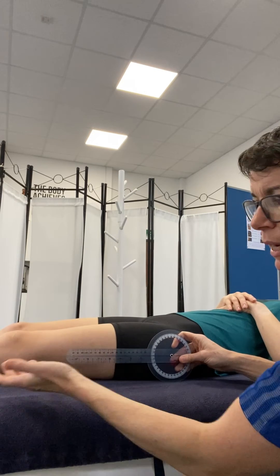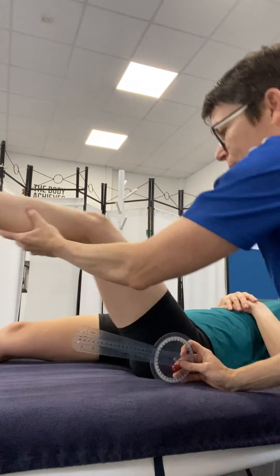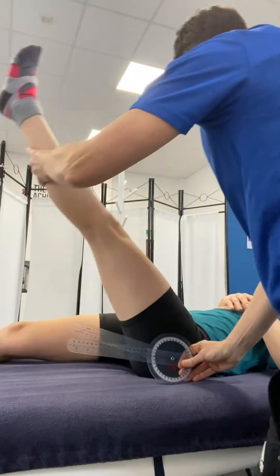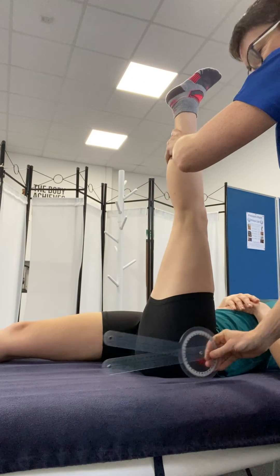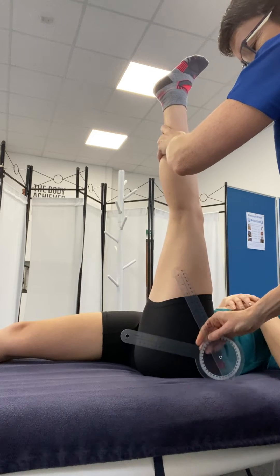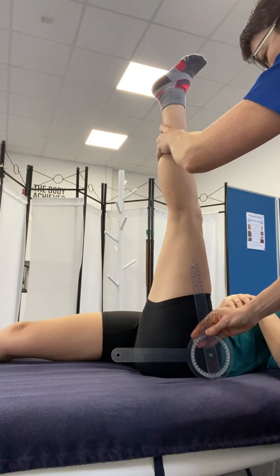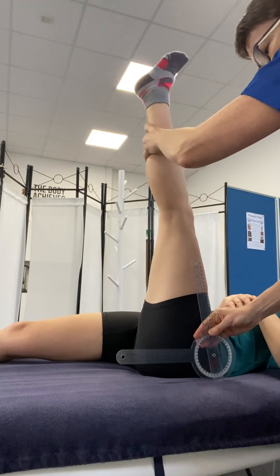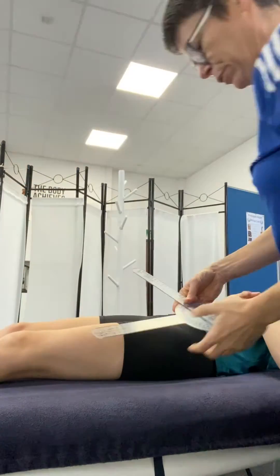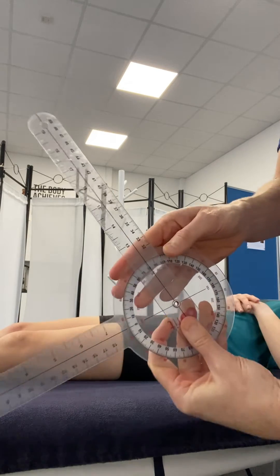Then passively, we're going to take the client's leg into flexion. Where you start to feel that resistance, with the other hand you're going to take that to the lateral knee joint line in that position. Once you've got that, the client can relax, then you take your goniometer off to read - and we're on 80 degrees for that one.